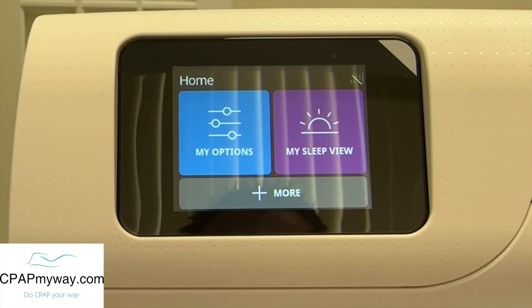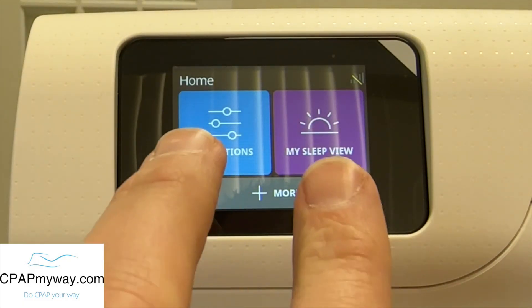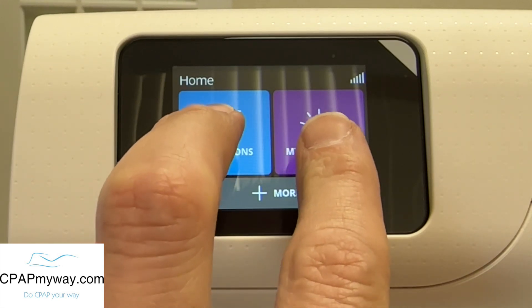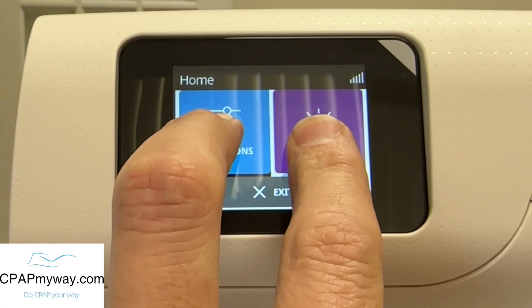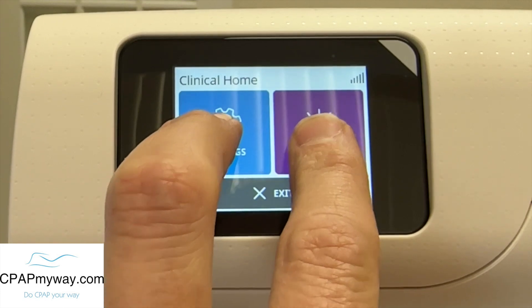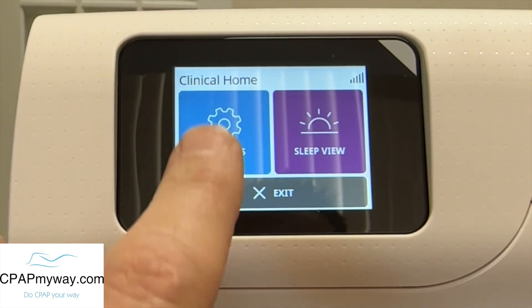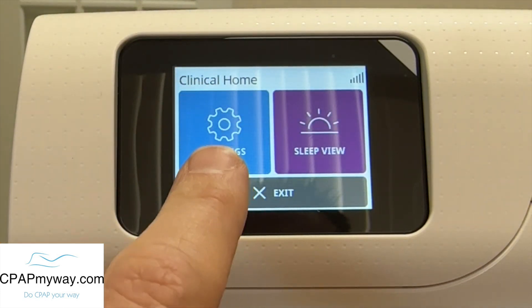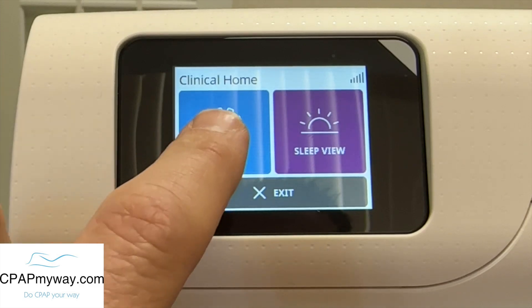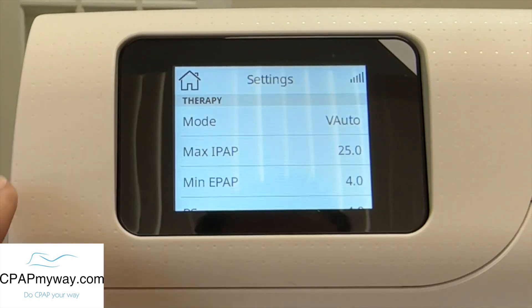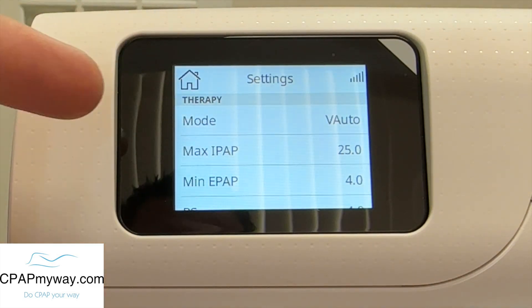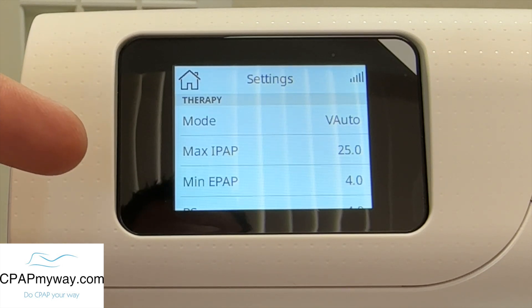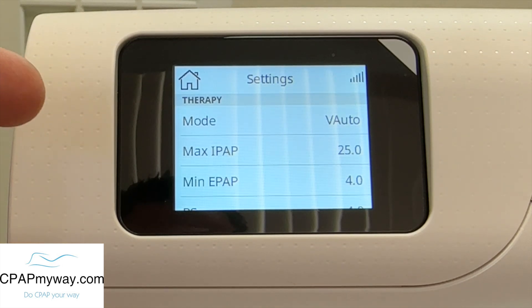So the first thing we want to do is just go over how to access the menu. What you'll do to access it is press and hold both of these icons here on the front — the blue one and the purple one. You'll notice the screen change, you'll see clinical home. Now you're going to press Settings and you're going to be in the therapy settings or provider mode. If you don't know what you're doing, please don't adjust any of this stuff.